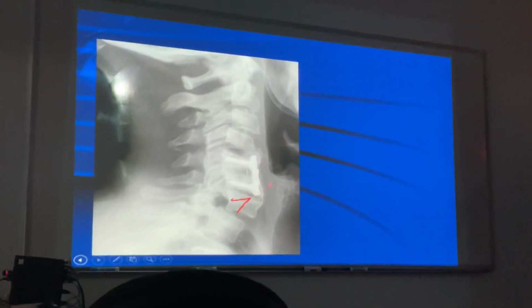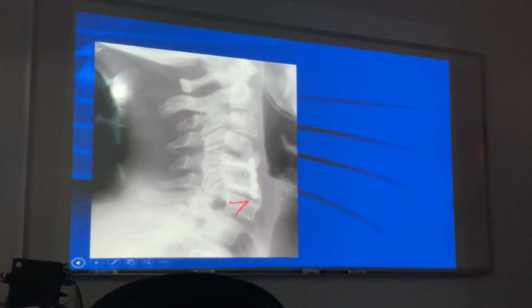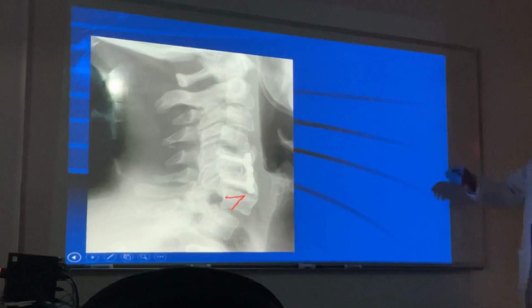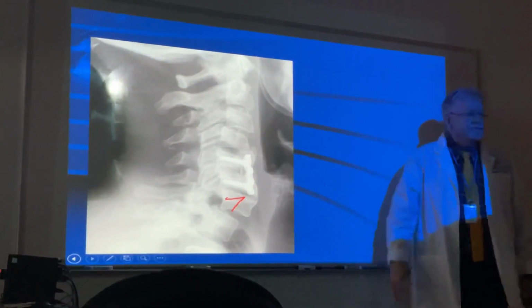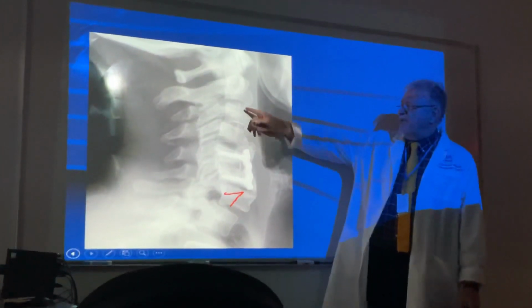For you is vertebral body. Now you say, how do we know that? Either I remember it from last time, but this is a metal density. You shouldn't have a metal density in your cervical spine unless it's been surgically introduced. Okay? Now, even though it's metal, this is a normal disc height. What's happened here? It's more anterior. More anterior? Is it the same height as this?